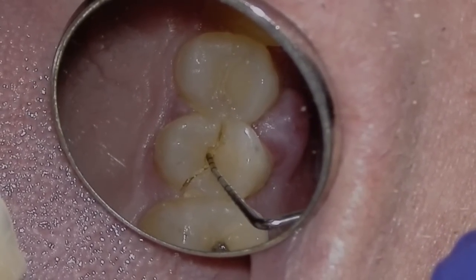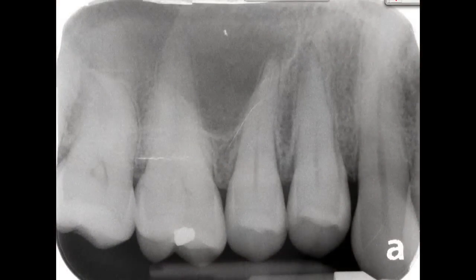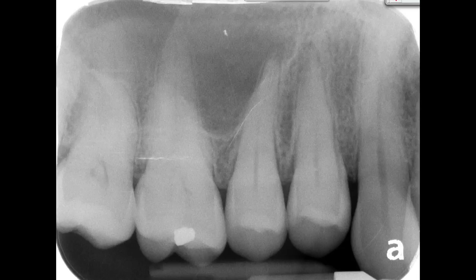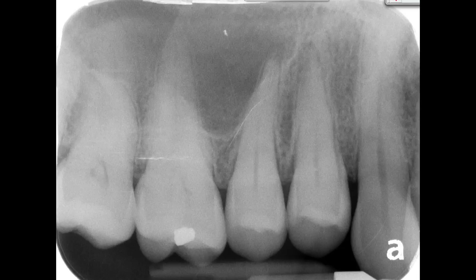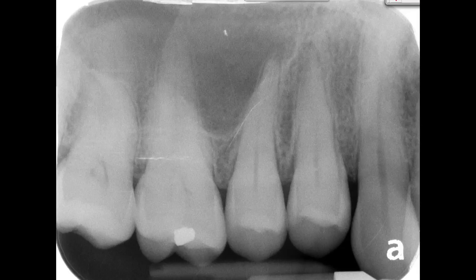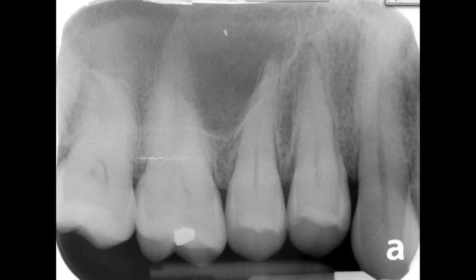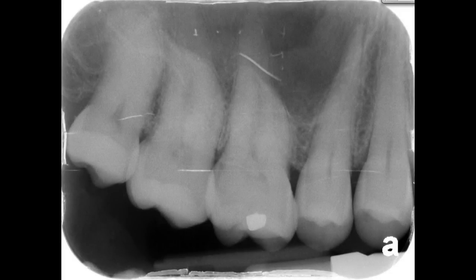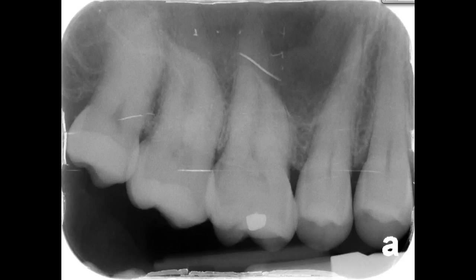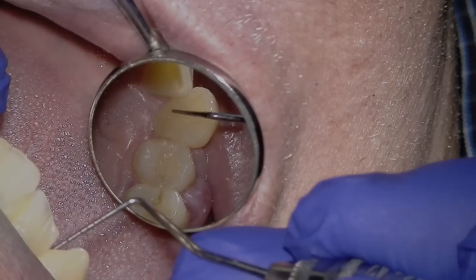Here we're going to flex it, and that's confirming that we have a split tooth. Now, you can see on the radiograph — tooth number 1-5 and tooth number 1-4, so both bicuspids — they actually have radiographic indications of a lesion. And you always have to wonder when you see that on a periapical radiograph. The question is, why are these teeth necrotic? And likely it's got something to do with the fracture. This is another radiograph, just more of a distal shot. I elected not to take any more radiographs after seeing the patient — these are the ones that were sent with him — because there was no need, seeing as the tooth was fractured.